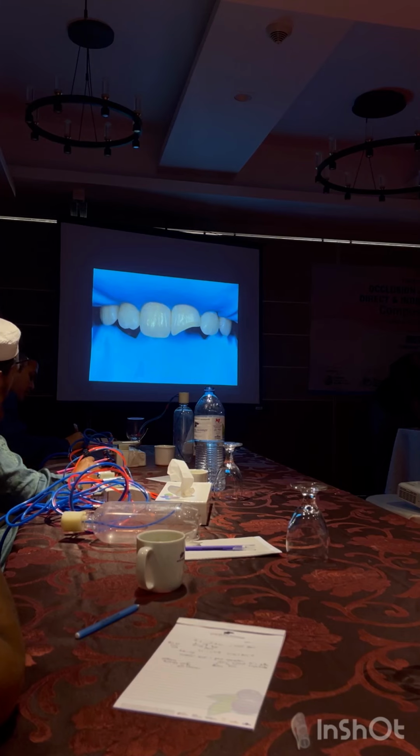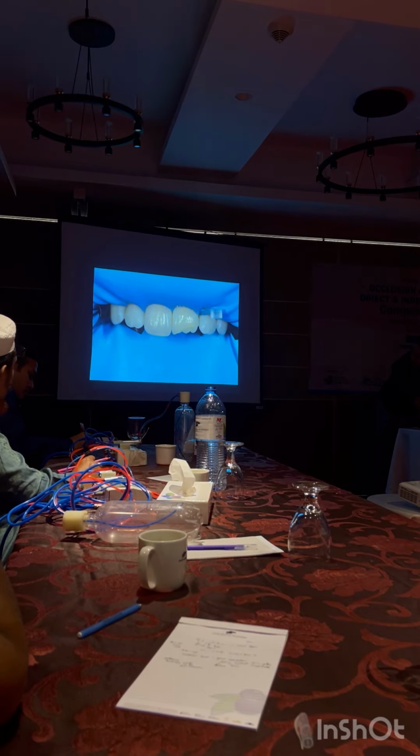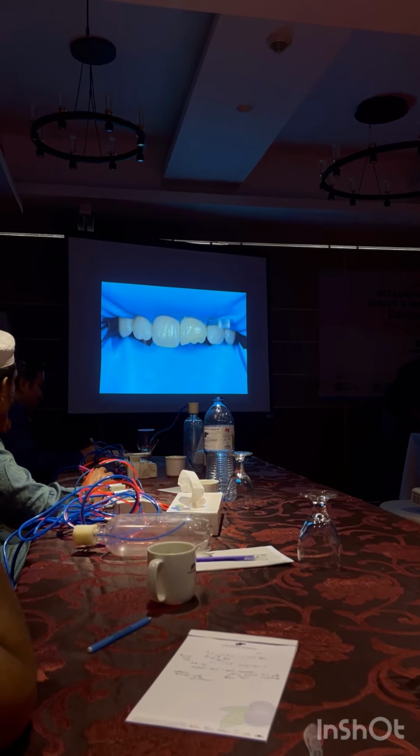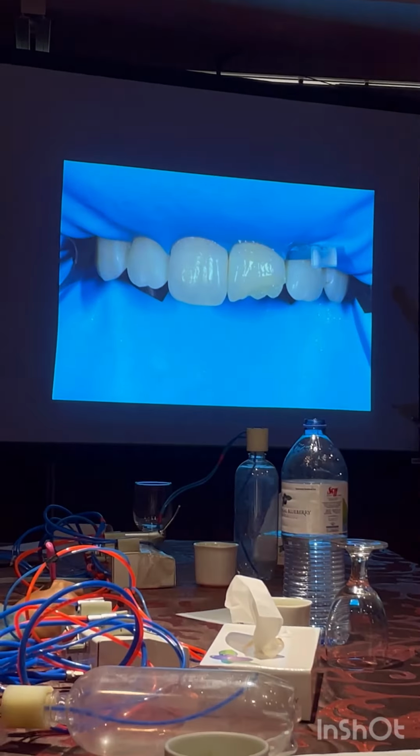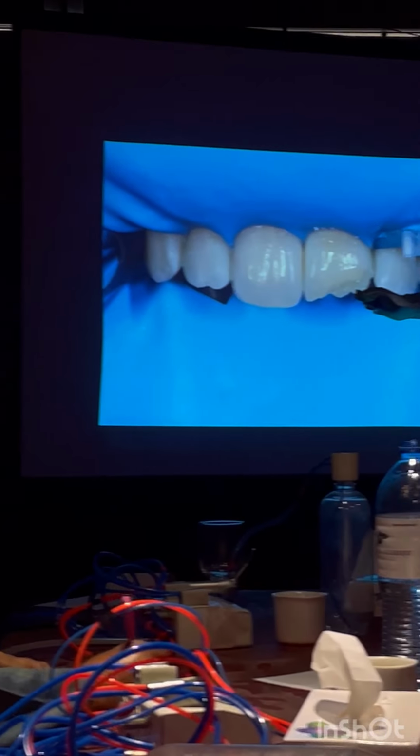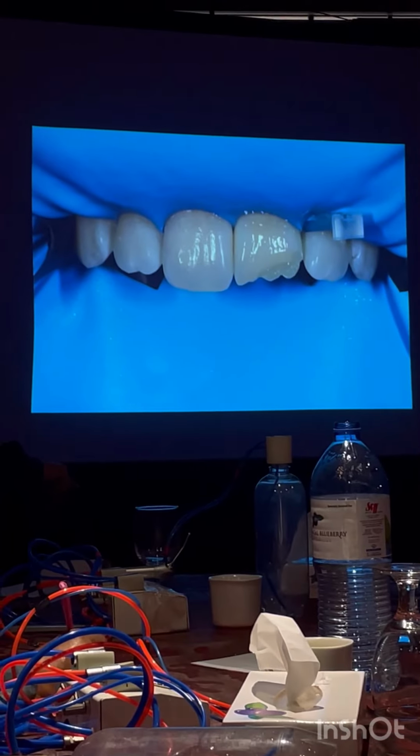So long bevel, scallop bevel, over etch, bond. And now I do freehand, okay? I do freehand.